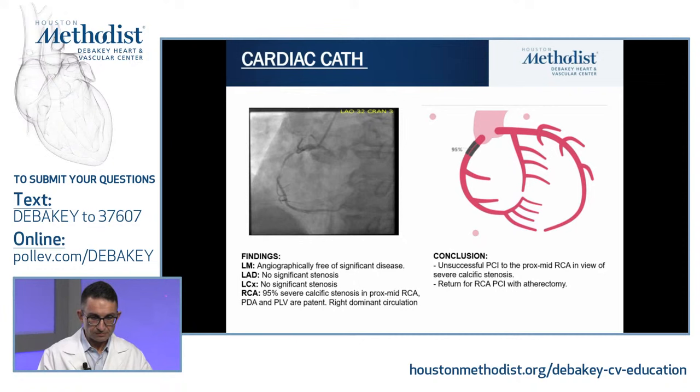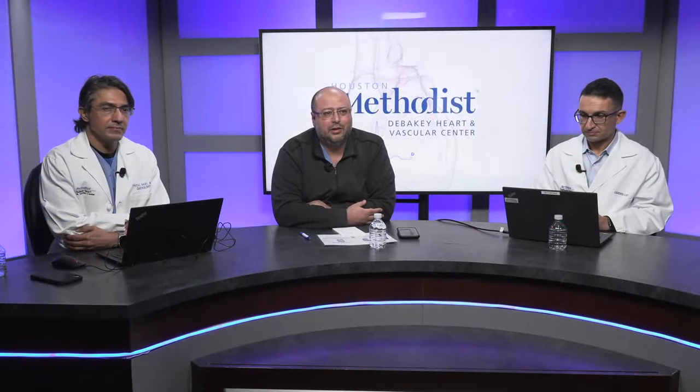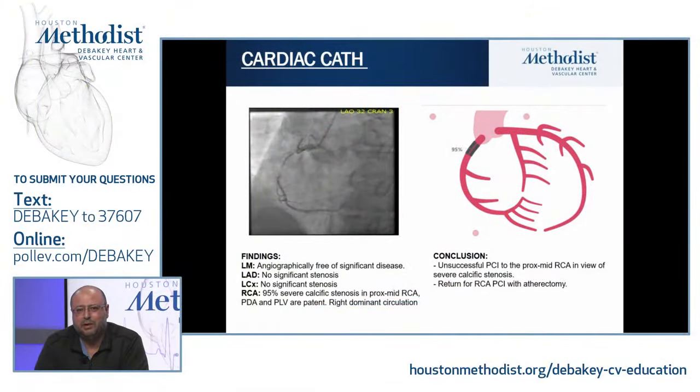So very important to show the added value of perfusion imaging in general among patients with high calcium score, but not just the perfusion imaging, but also the quantitative, the absolute assessment of these patients, because there are often many cases that have high calcium score and might have more than just one vessel. And this is where you need quantitation to be able to differentiate single from multivessel disease. Exactly, thank you.